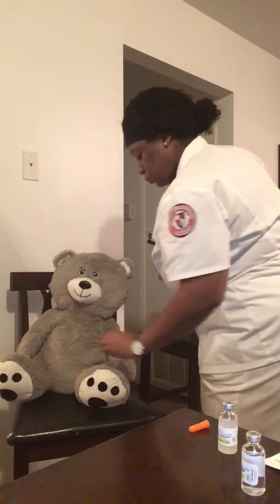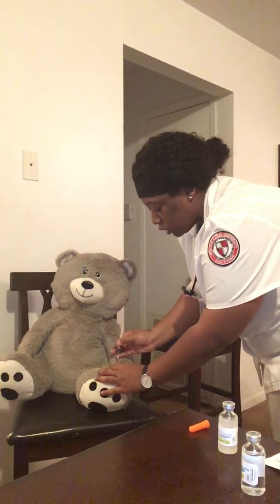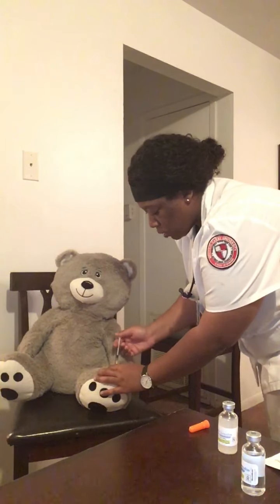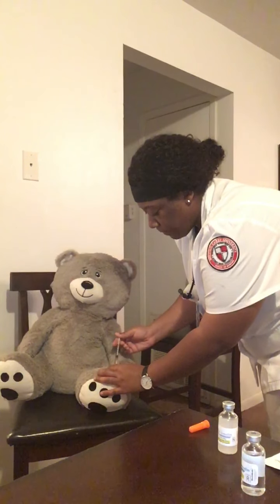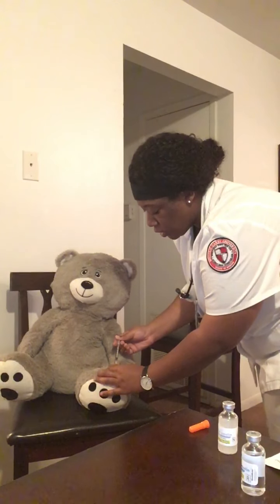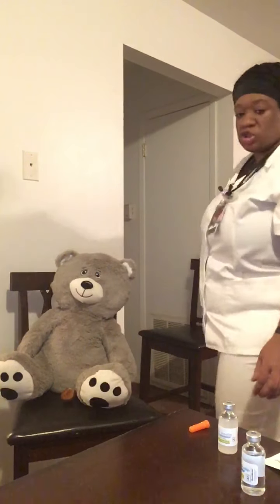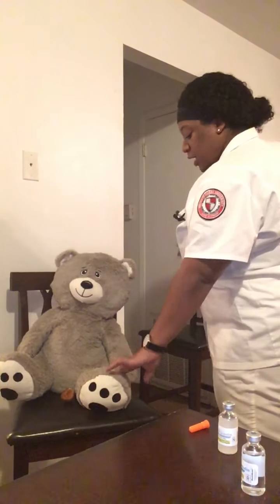If I could pinch 1 inch, I would go at a 45-degree angle. If I could pinch 2 inches, I would go at a 90-degree angle. But I think I can only get about 1 inch pinch here. So we're going to take the cap off. I got 1 inch. I'm going to go at a 45-degree angle. 1, 2, 3. And we're going to inject slowly. We're injecting slowly here. Draw back, pull up my safety, dispose of this in a sharps container, take an alcohol swab, and gently press.